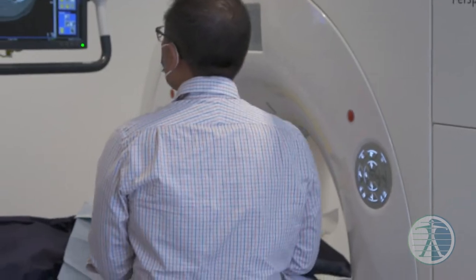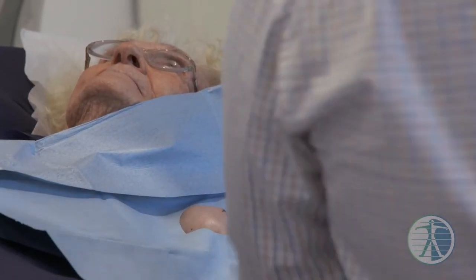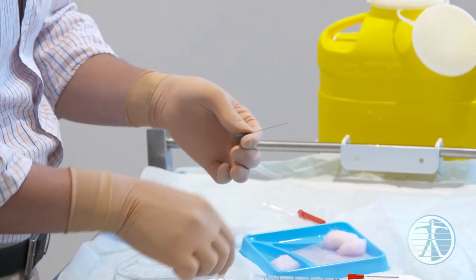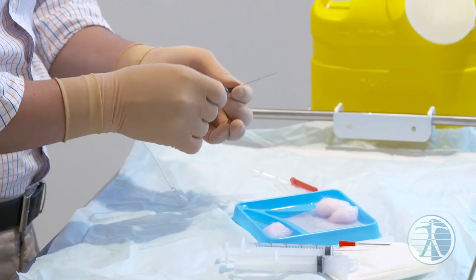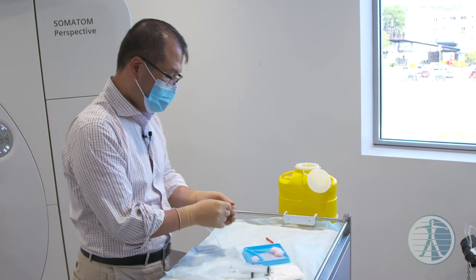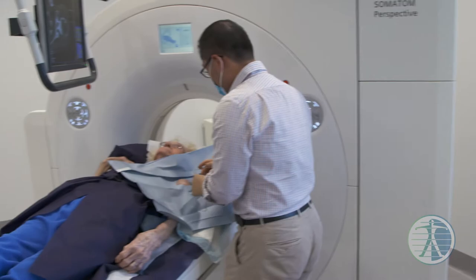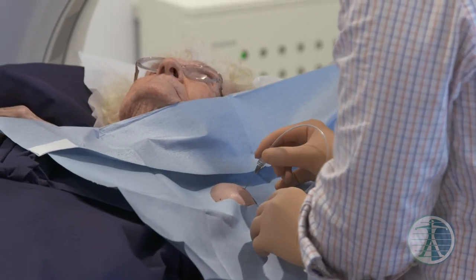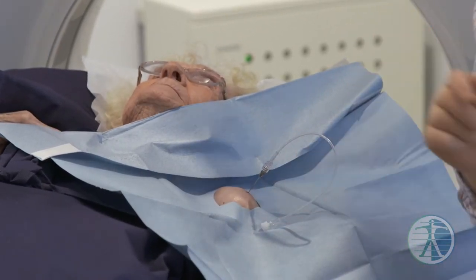A bit of lubricant. We're going to put the needle into the joint. We're going to put this needle in now. We're going to take an image here, okay?